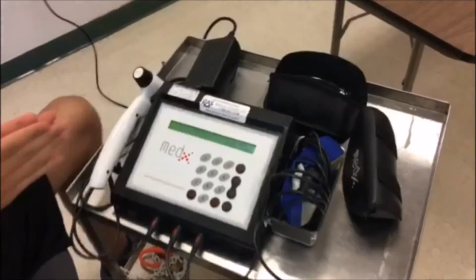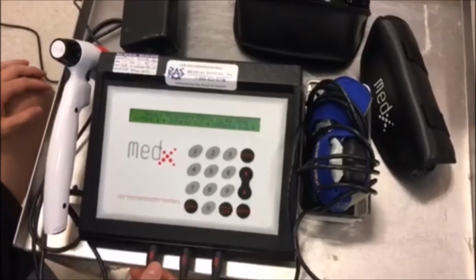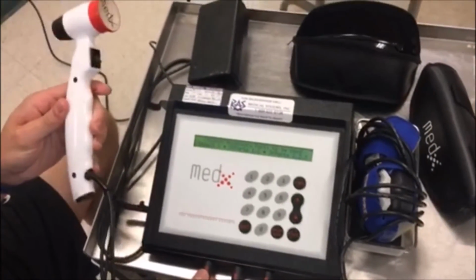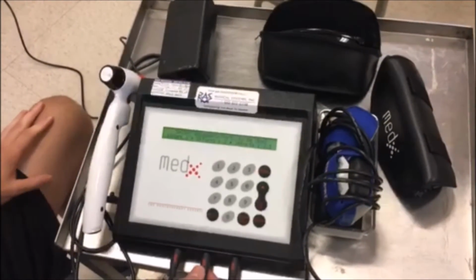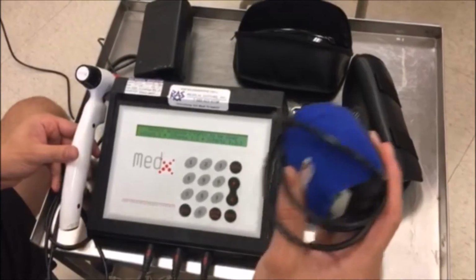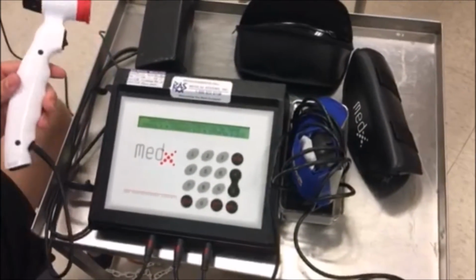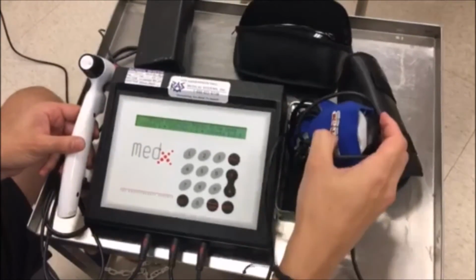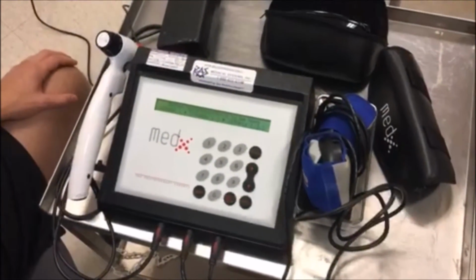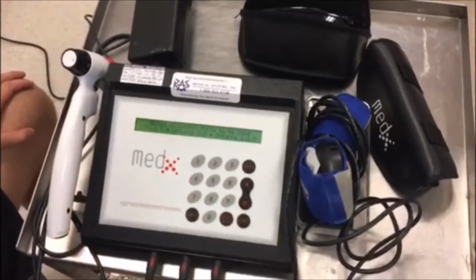If we jump into the menu now, we're prompted to select either ports 1, 2, or 3. If we select port 1, we're only going to administer this laser treatment with the laser gun over here. If we select port 2, we're going to administer a laser treatment as well as an SLD treatment with one of these pads here. If we select port 3, we're going to administer a laser treatment and SLD treatment with both of these pads here. The good thing about this machine is that if you get confused or forget how to handle it, you can just read the menu.